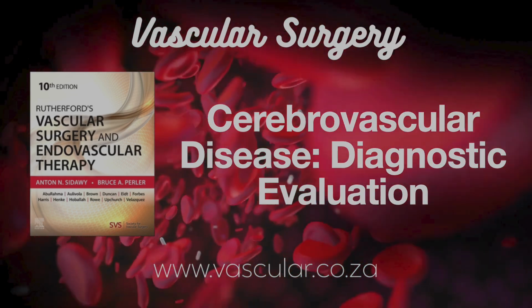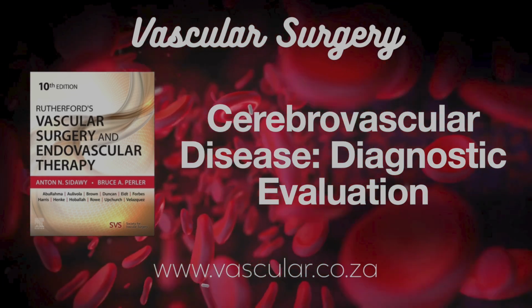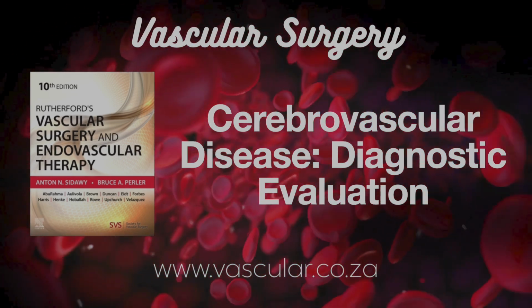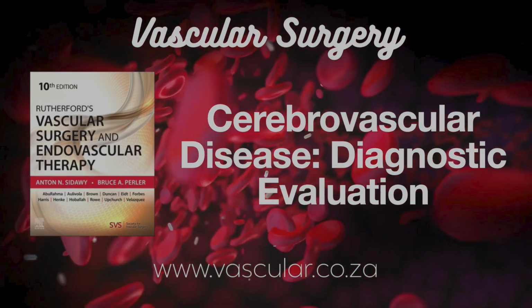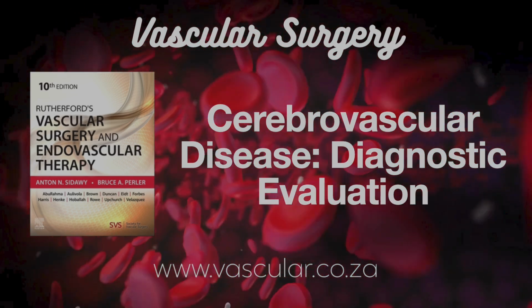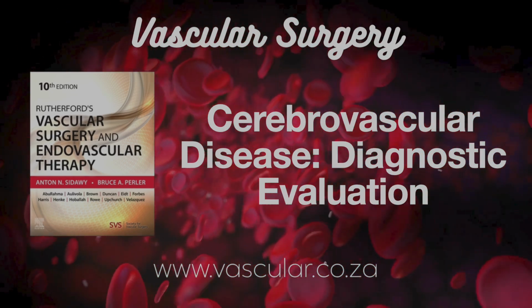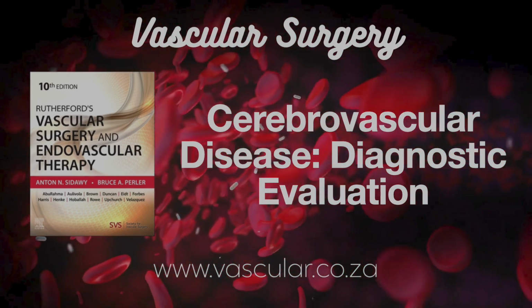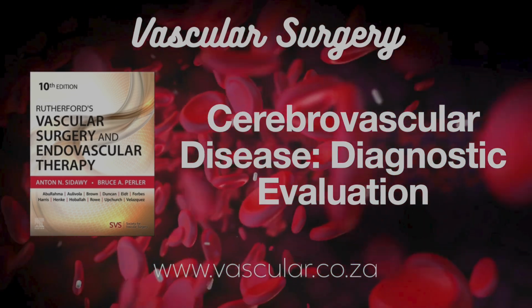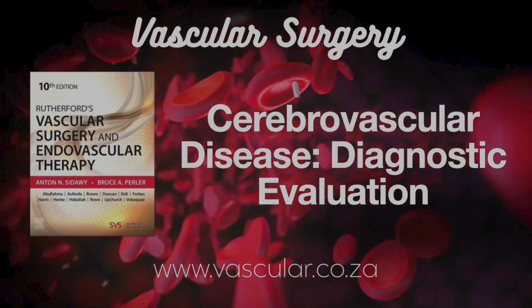Wow. That is impressive. But, like you said, everything has limitations. Where does DU fall short? What can it show us well? Yeah, good question. It's our workhorse, but it definitely has blind spots. For one, bone gets in the way. So seeing the arteries way down low below the collarbone or way up high above the jawline, that can be tough. Like anatomy limits it. Also, something interesting, if you have a really bad blockage or even a total occlusion on the other side, the contralateral side, that can actually change the blood flow patterns on the side we're looking at, potentially making us overestimate how bad the stenosis is. The good side might be working harder, speeding up flow artificially. So one side affects the reading on the other.